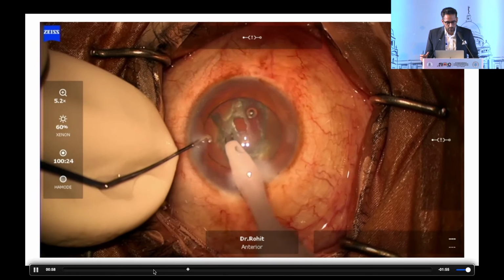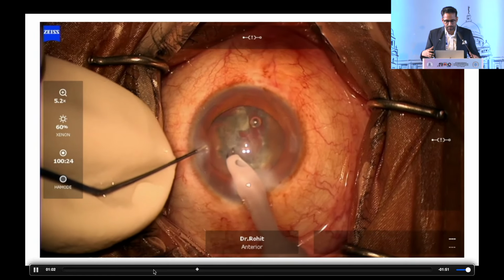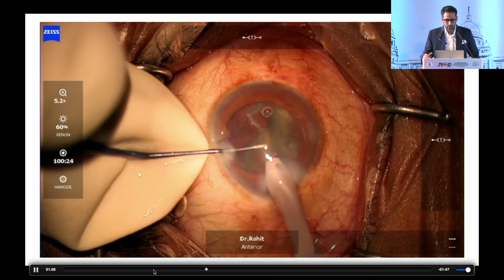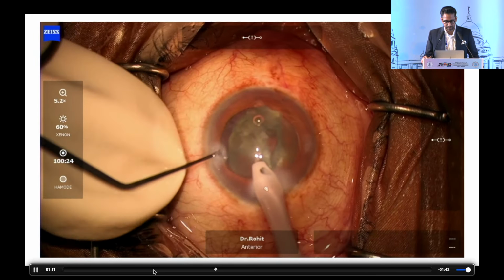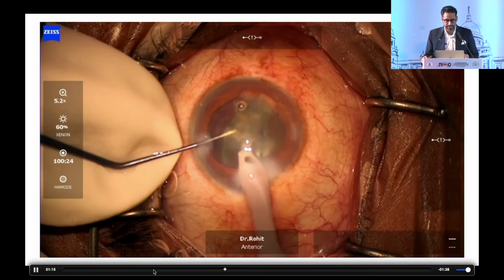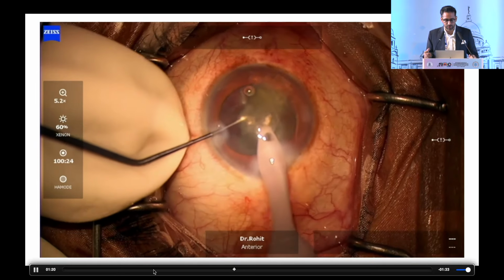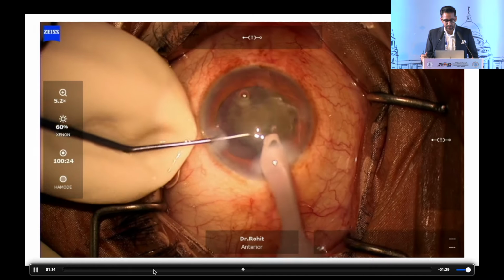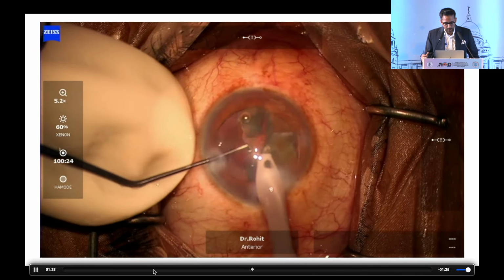The advantage of low IOP phacoemulsification, as rightly said by Dr. Rohit, is that there are minimal pressure differences between the anterior segment and the posterior segment. So these nuclear fragments float in the anterior chamber. Another important thing is that your incision should also be calibrated, because you can't afford efflux from the side ports or the main port incisions, which causes instability in the chamber. You can see here there is no undue deepening of the anterior chamber.